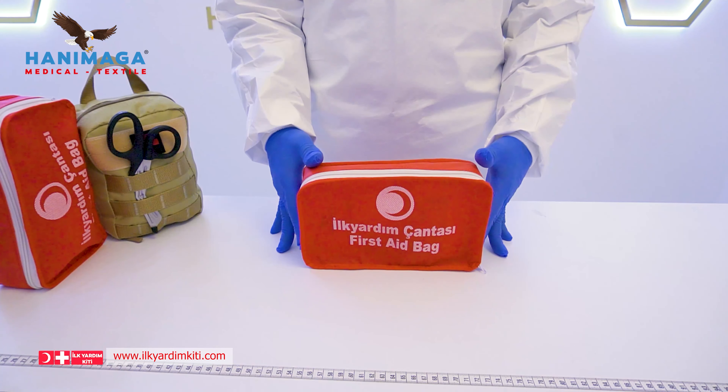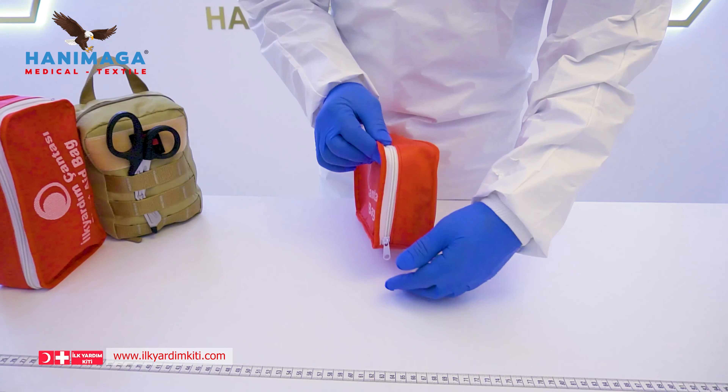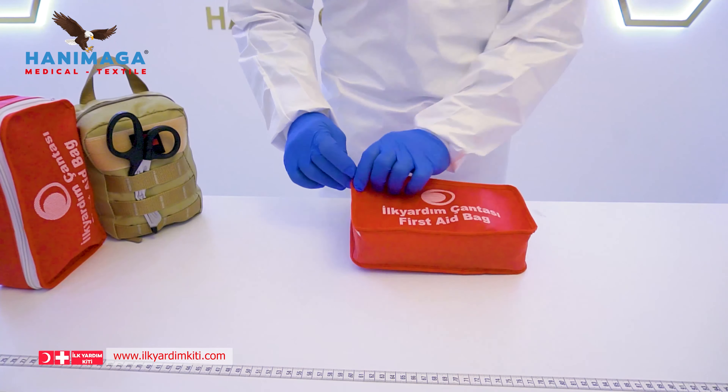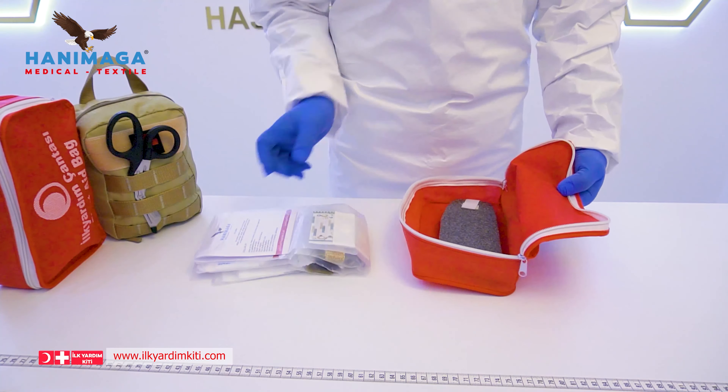We are here with the promo video of Hanemar Medical first aid bag standard kit. Our standard kit first aid bag comes in a non-woven bag, zippered and single section. When we open the bag, you can see what's inside.